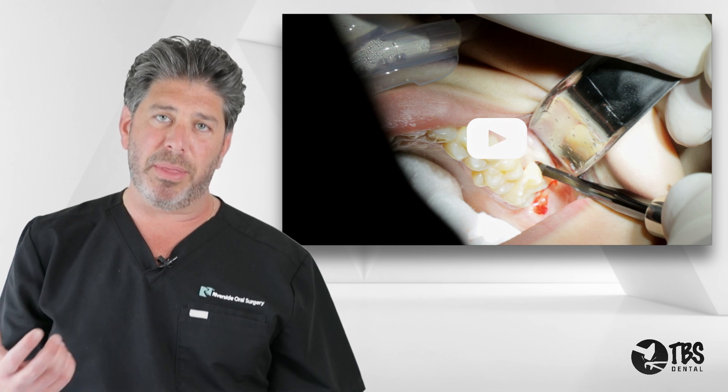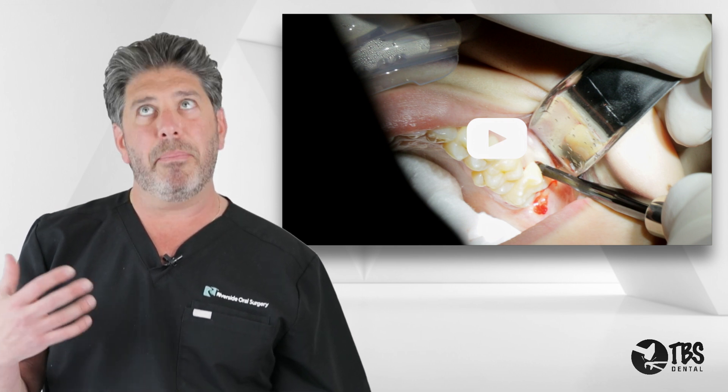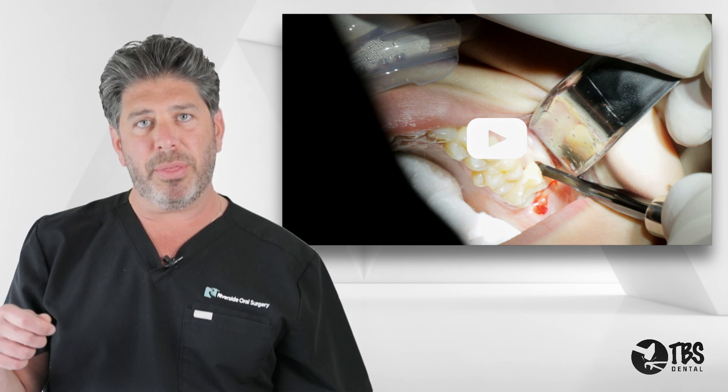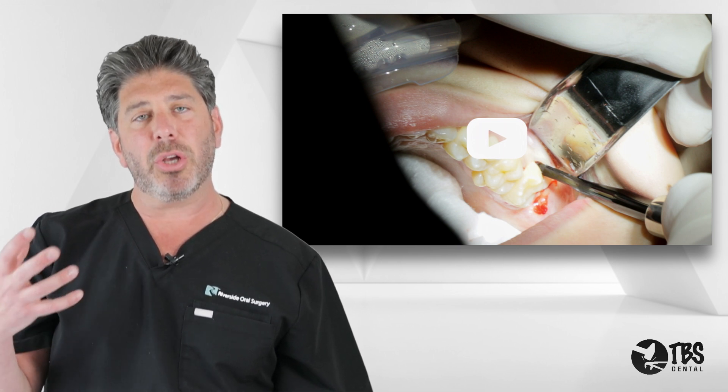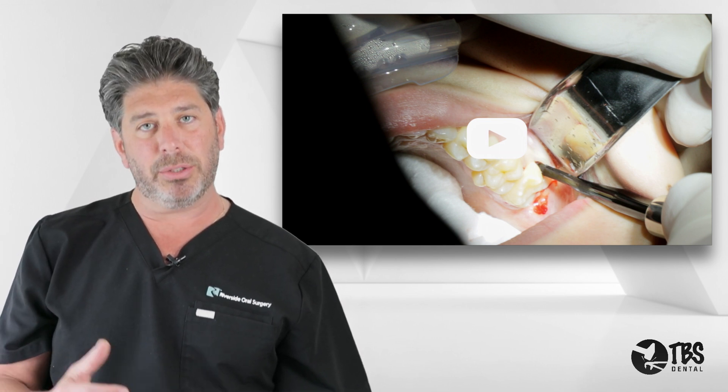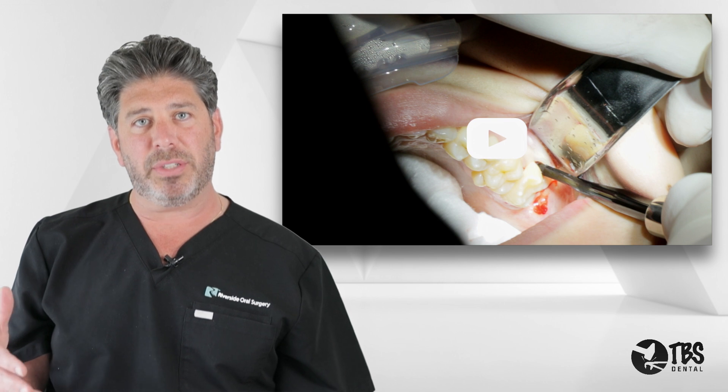That allows for the greatest visibility and also allows me to remove some of the soft tissue, which is often a big concern when removing an upper third molar. We can be pushing with our elevator, but the soft tissue will prevent the easy extraction — so it's all in that flap design. I'll open the lower soft tissue and open the upper soft tissue.